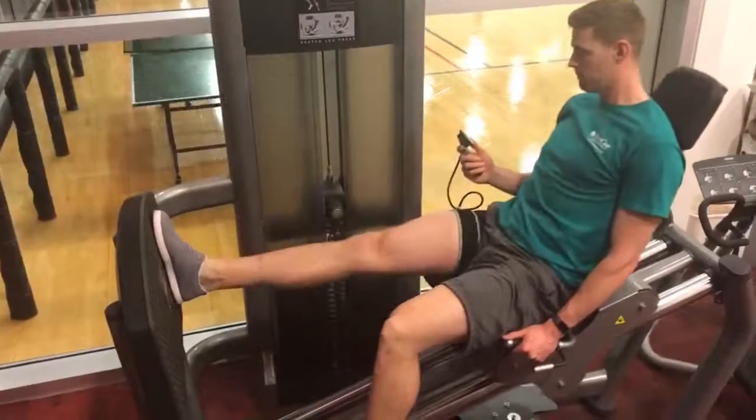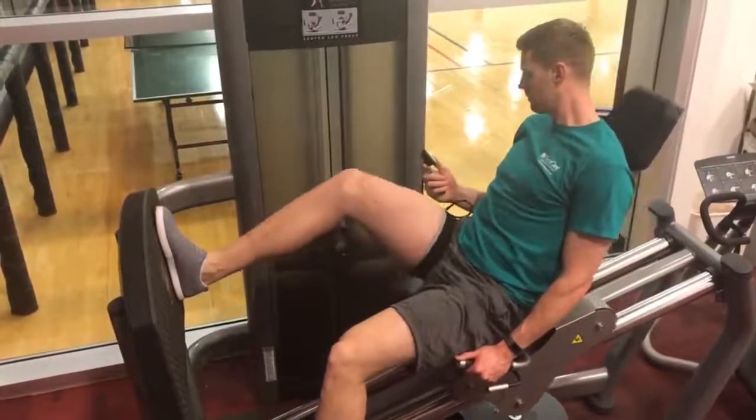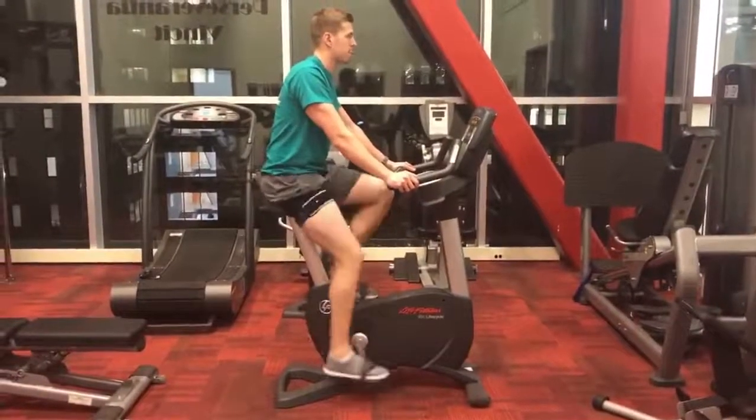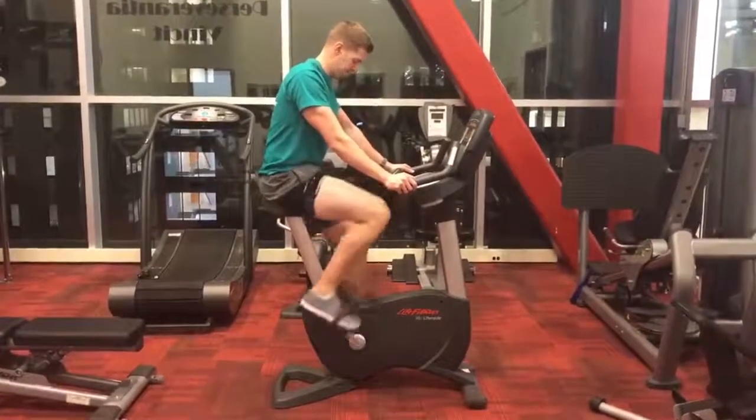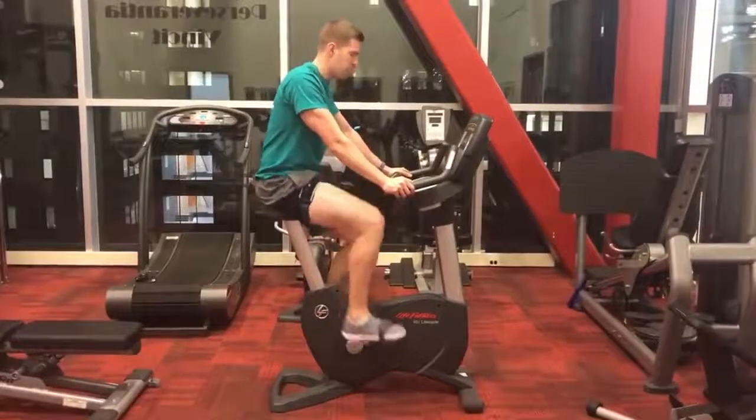BFR can also be used during endurance training such as an upright bicycle and maintained for 10 to 20 minutes as you progress. Elite athletes would utilize BFR up to three to six times per week for the first 16 weeks post-op as part of their rehab plan.